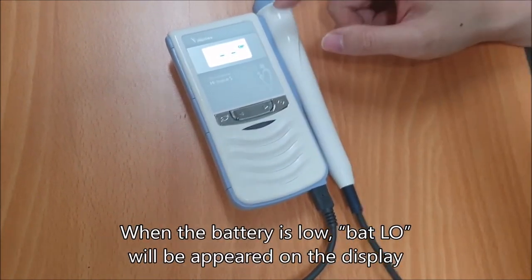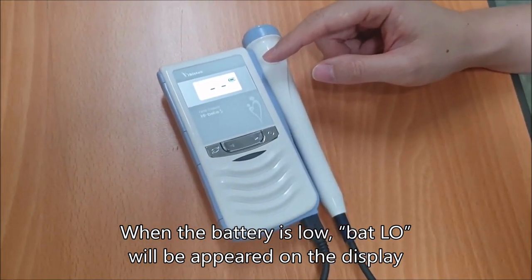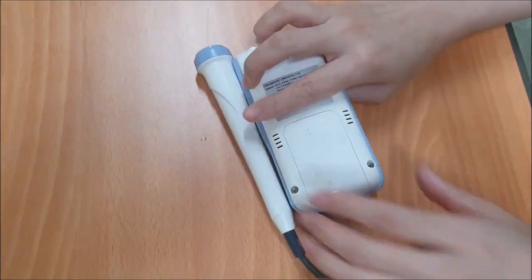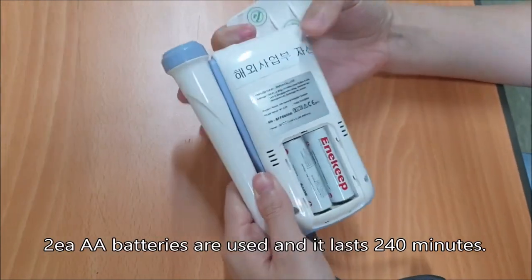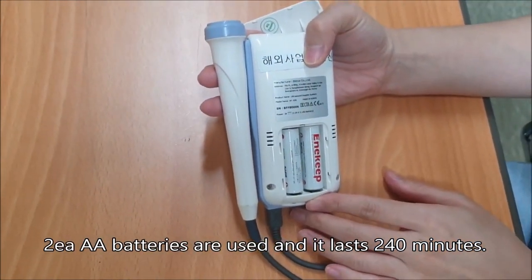When the battery is low, BATLO will appear on the screen. Two AA batteries are used and the device lasts 5 hours.